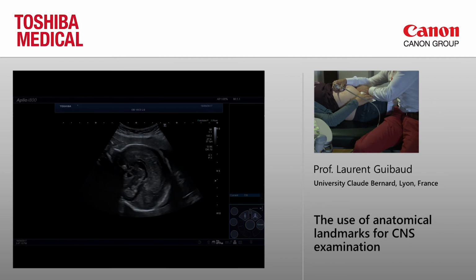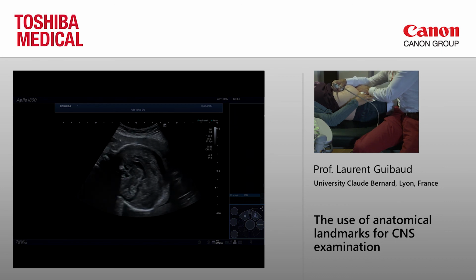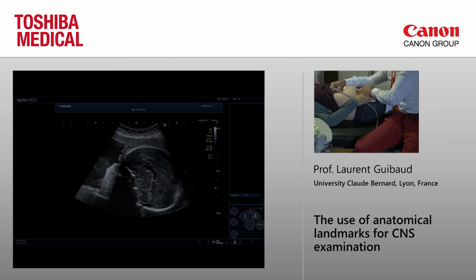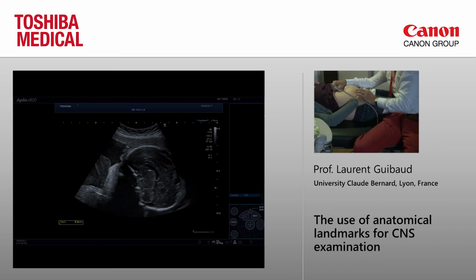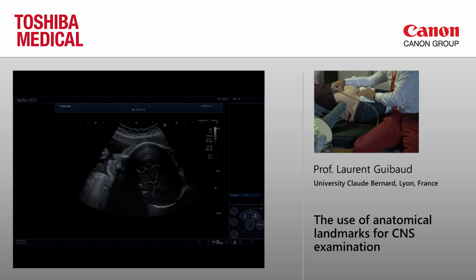But you see, according to the way of scanning, you can have a good genu of the corpus callosum. Okay, you see the vermis, clearly the vermis. You have the corpus callosum, but I want just to see the most anterior part of the corpus callosum, because here you see the genu, which is here, and you see the splenium. But we are not orthogonal, but I try to do my best for you.